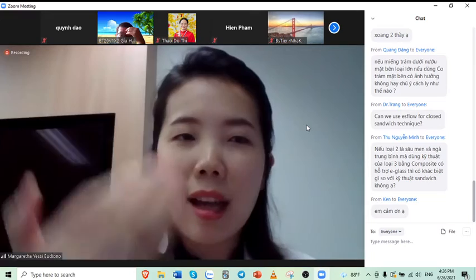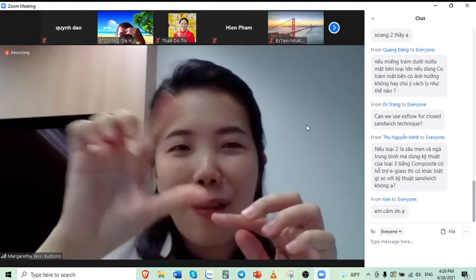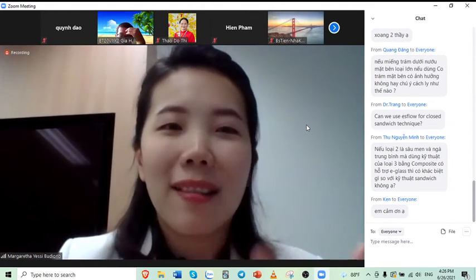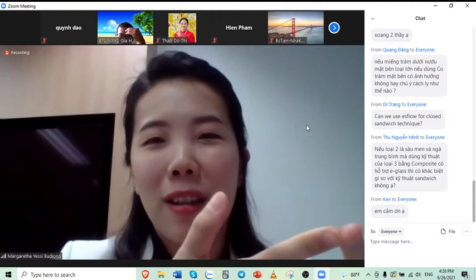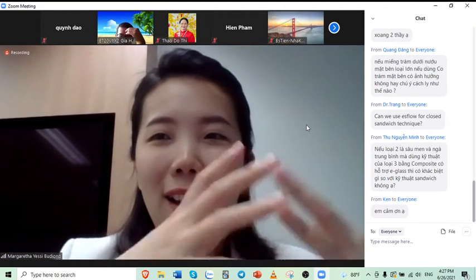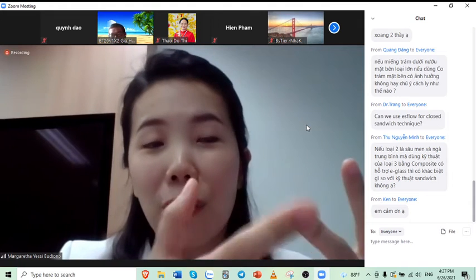But I understand getting the rubber dam down below, if the margin is really far from the gum, is quite difficult also. In this case, I will still recommend you to use glass hybrids because they can still tolerate a certain degree of moisture, and it's also kinder to the soft tissue there.